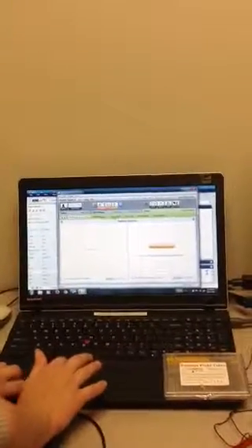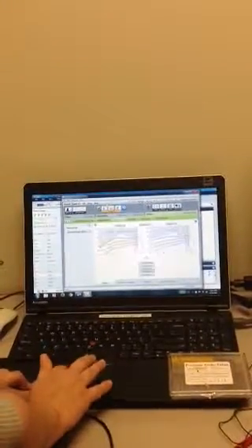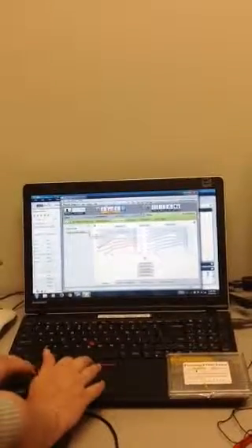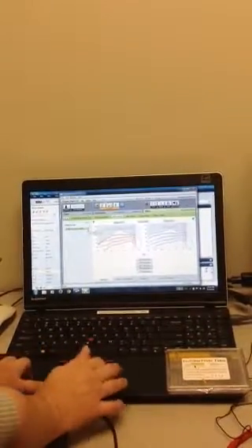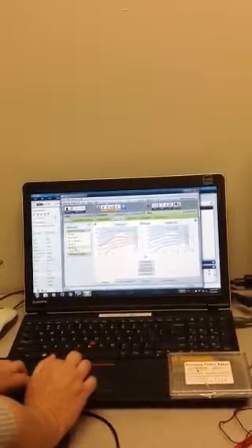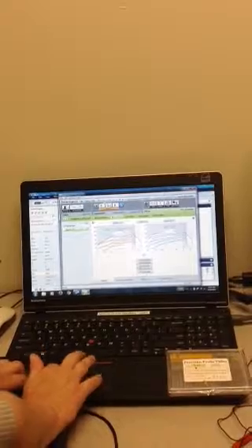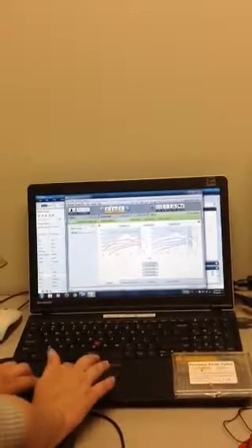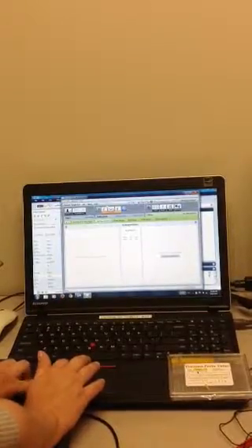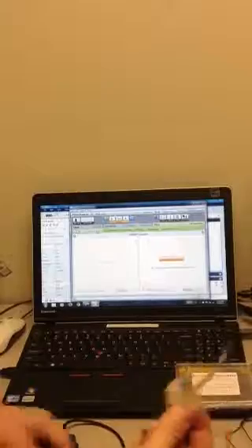And then I'm going to go into the fitting tab and then go to basic tuning. It defaults the settings to Phonak's proprietary settings. I'm going to switch that in the drop down to NAL-NL2. And then once again it will reset. Alright, so now I'm going to go with Phonak. It wants us to do a feedback test first. So let me get her set up for actual programming.